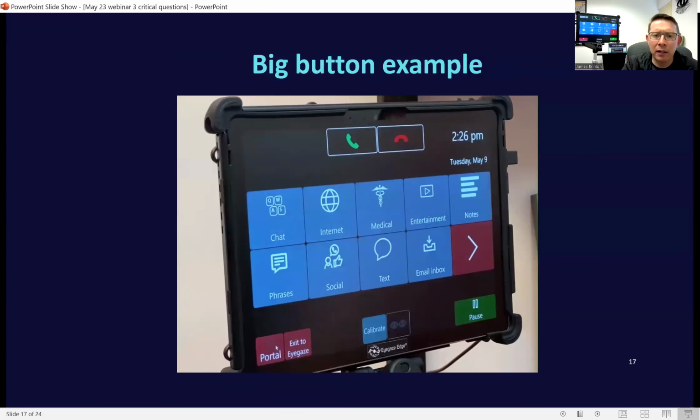Let's say that they were struggling on a keyboard. We might move to some bigger buttons, medium-sized buttons, and just give them practice. We're going to be really aware of how they're responding to our direction and give them more or less cues as needed.